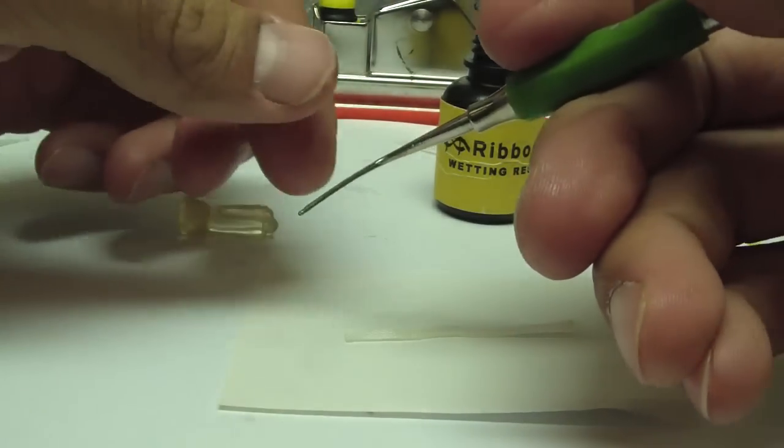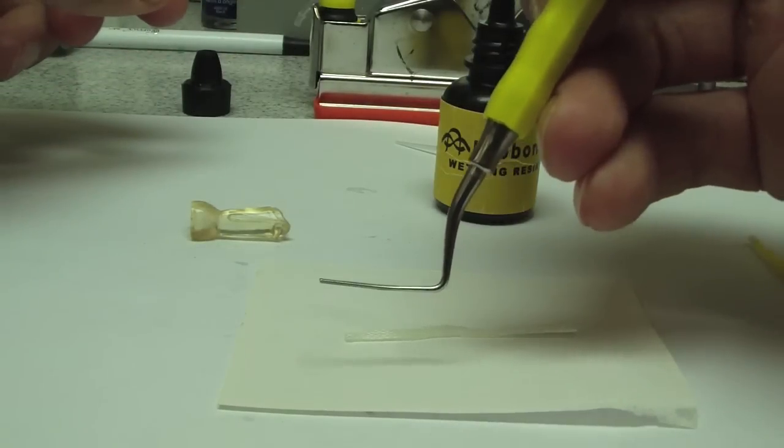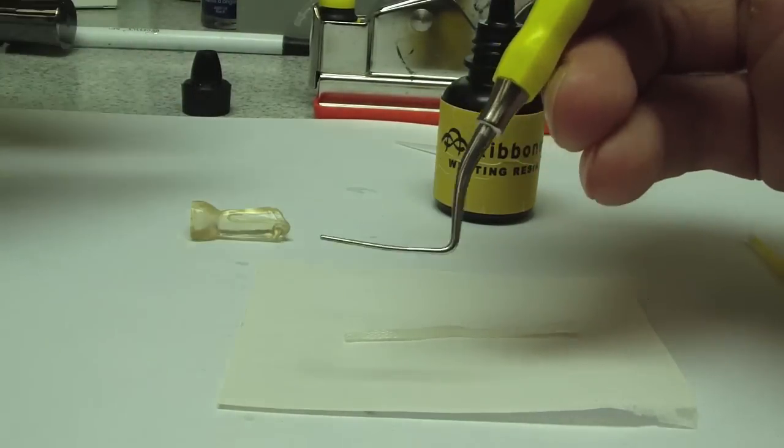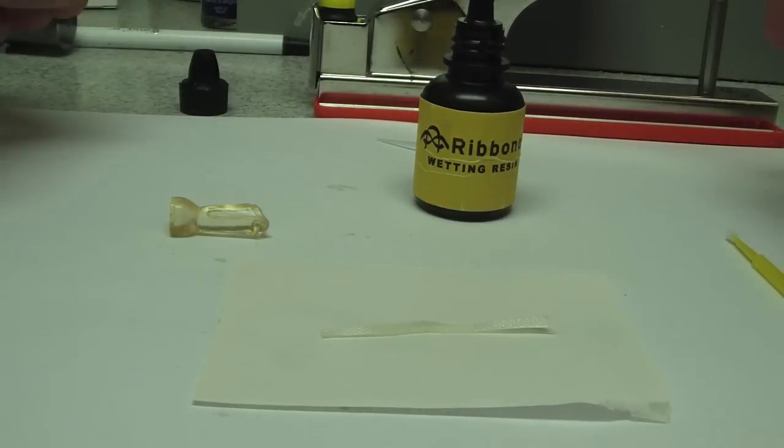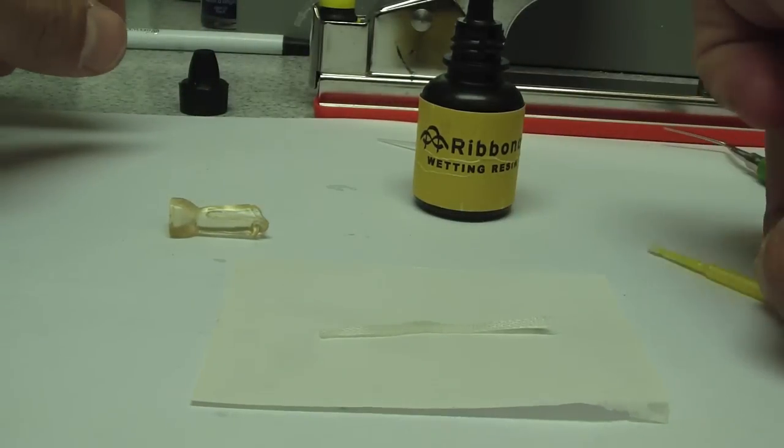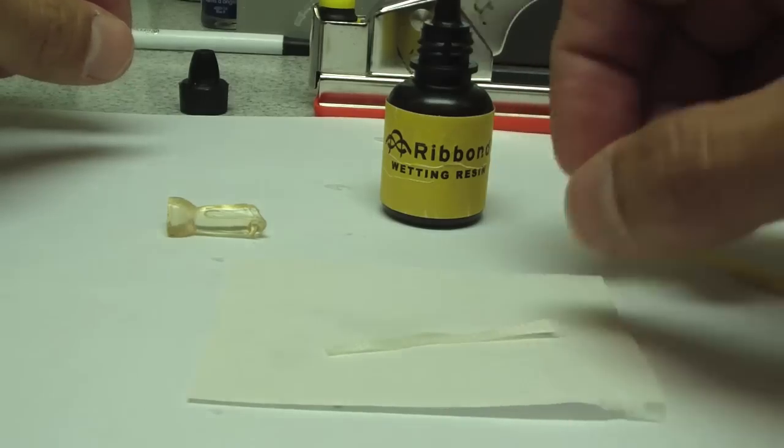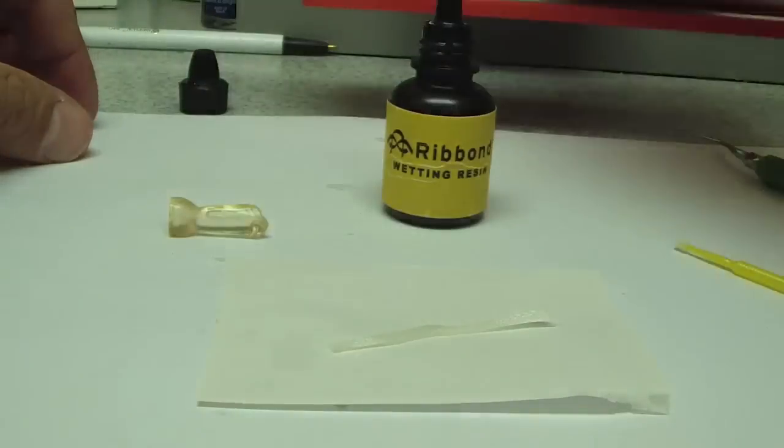Typically with a DT post or preformed post, the problem is that once it cures there's a bulk of resin which will shrink, so it's going to typically shrink away from either the wall or the post. I have a number of photos of my own experience of that using Relyx Unicem.